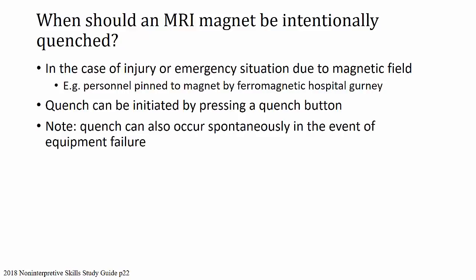A quench can be initiated by pressing a quench button, and you should note that a quench can also occur spontaneously in the event of equipment failure. So something to be watching for if the magnet can quench.